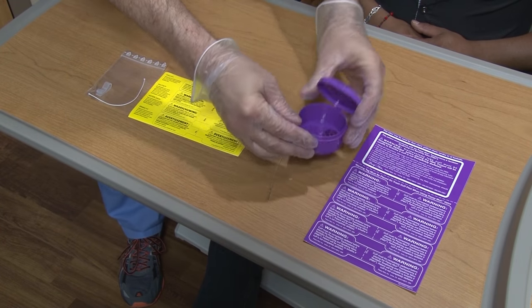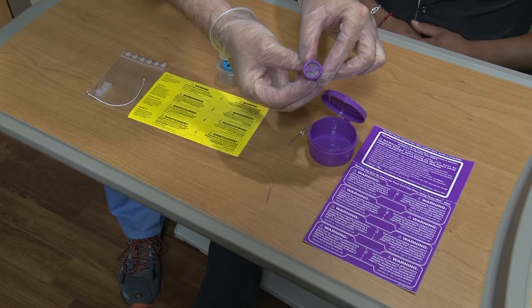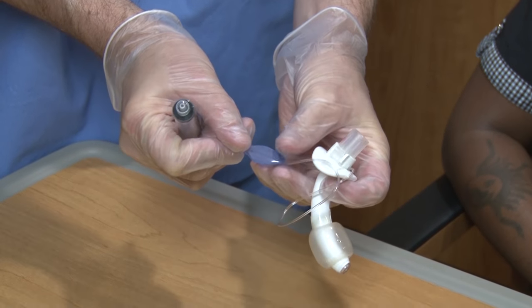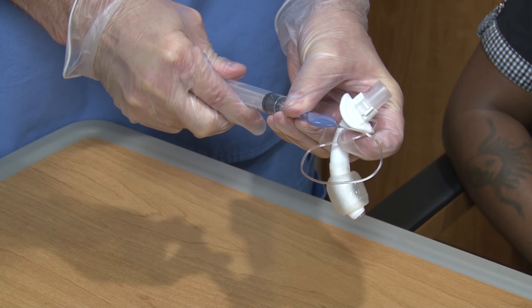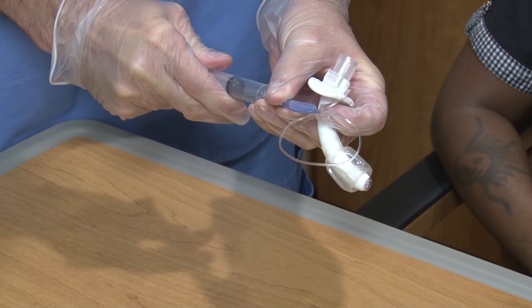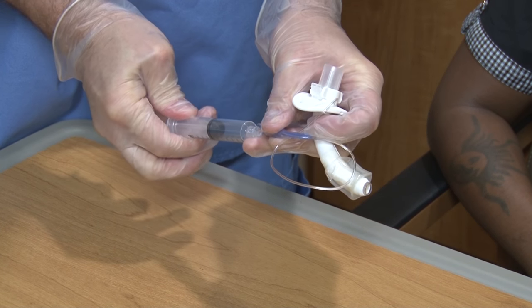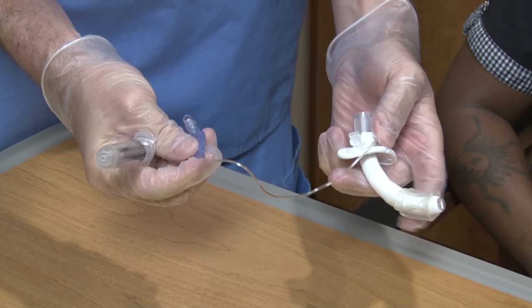To put the speaking valve on, take it out of the box. Find the pilot balloon of the tracheostomy tube and make sure that it is completely flat. If the tracheostomy tube is cuffless, you won't need to do this. If you find the balloon has air in it, do not place the speaking valve.